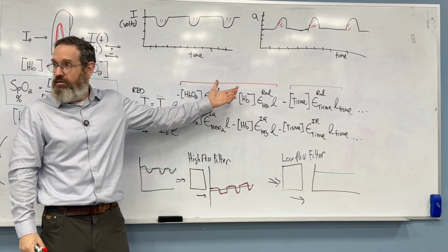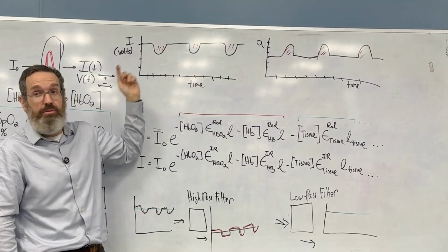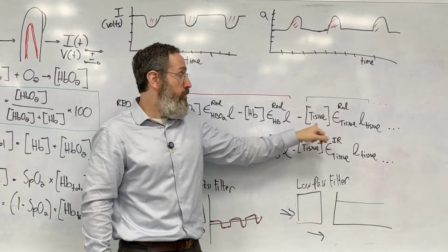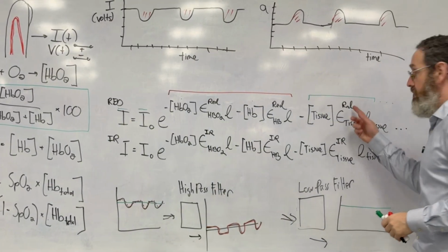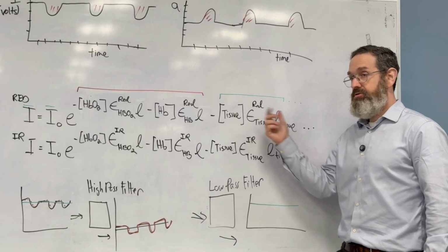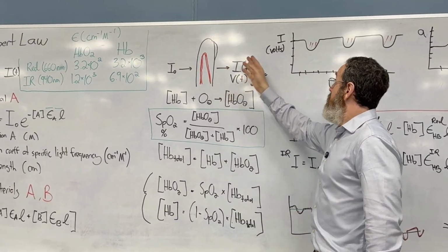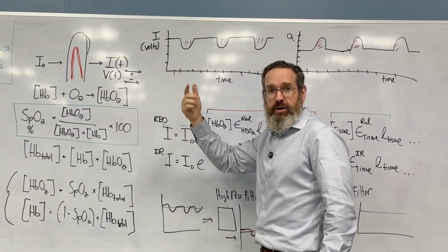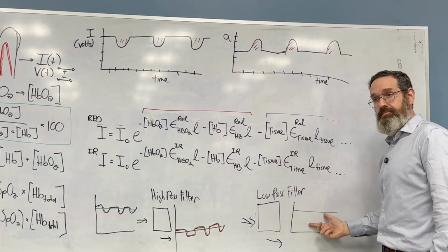The blood. We're going to assume that the only thing that's changing is the blood. What about bone? Oh, that's here. Does bone matter? It does matter, but it doesn't change. What about my sunscreen? Yeah, my sunscreen had an impact, but that impact didn't change every time my heart beats, right? So sunscreen is here. And I just stripped that out.